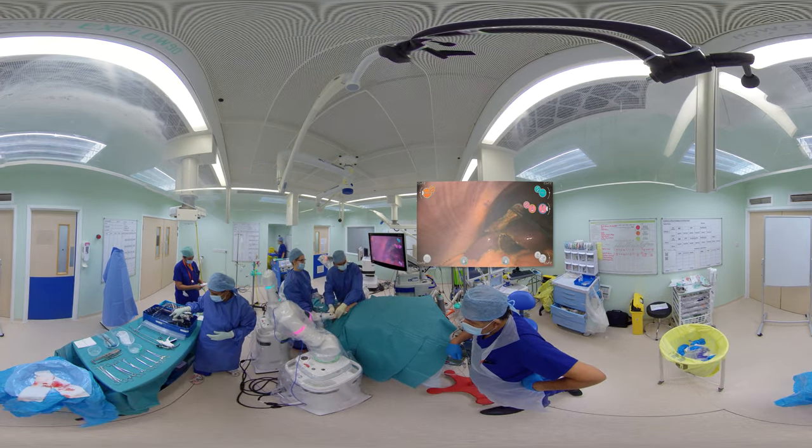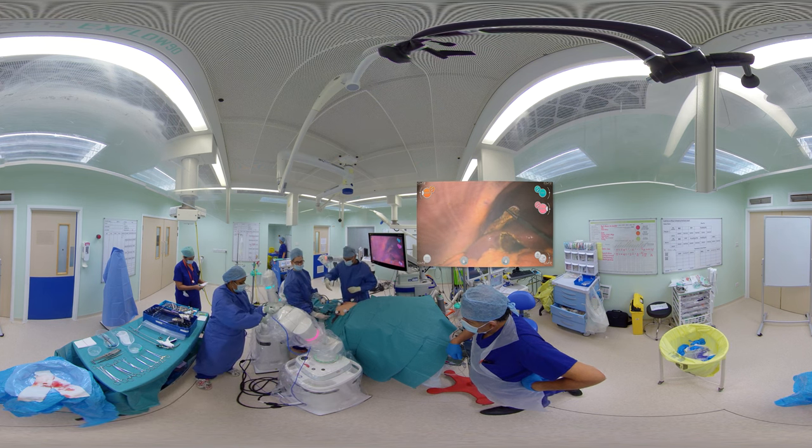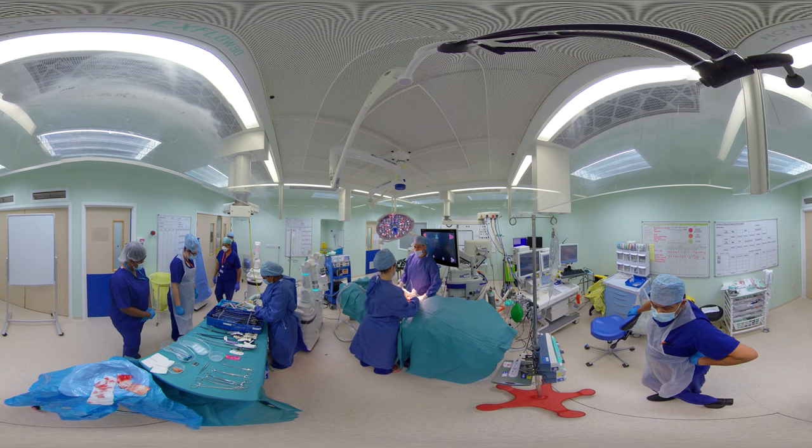The gallbladder is then placed in a bag for endoscopic retrieval of tissue and removed from the umbilical port site. We are now closing the ports.